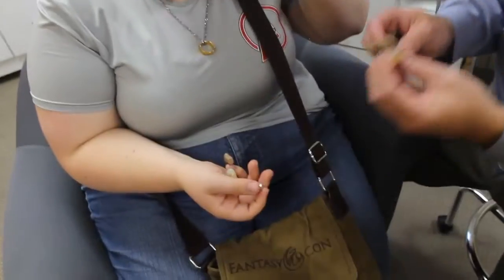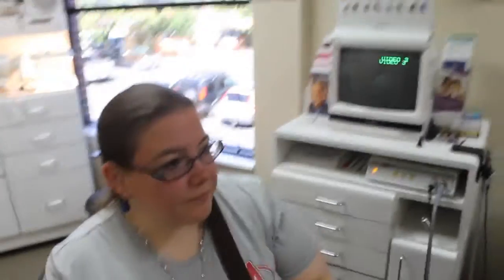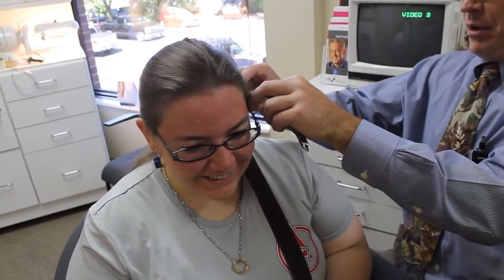Now, the other thing that I've done that's a little bit different is that your new ear molds are vented, meaning that there's a little ventilation shaft that goes through there. It's only what's called a pinhole vent. This one has one. I lied, they both do. As a general rule, we want to leave the ear canal vented if we can because it makes you feel less plugged up. Of course, you're used to feeling plugged up because you've worn hearing aids forever, so it's typically not that big of an issue.